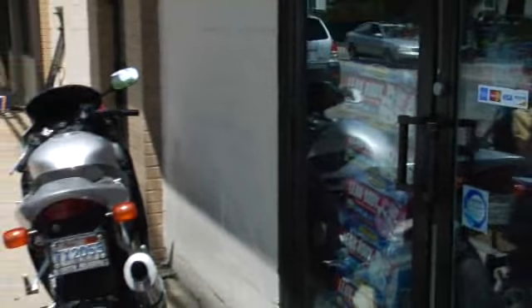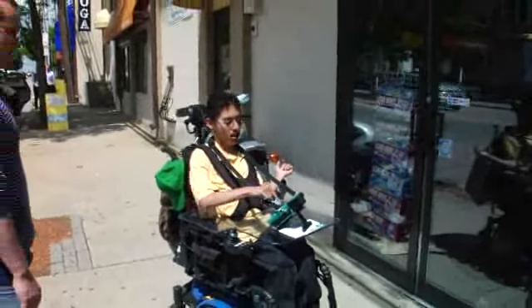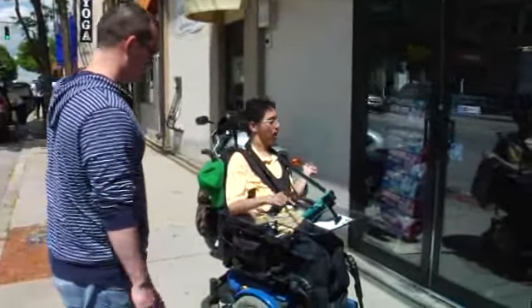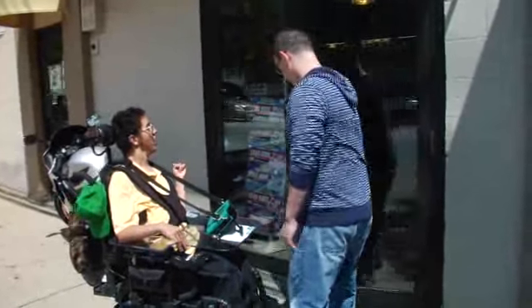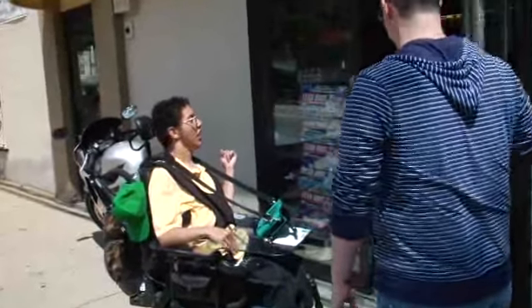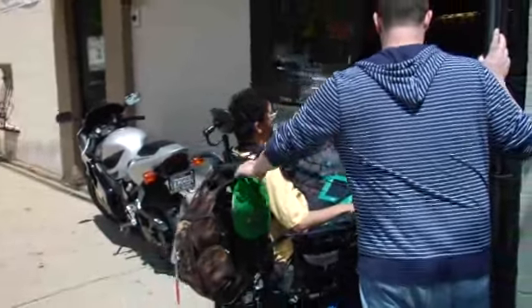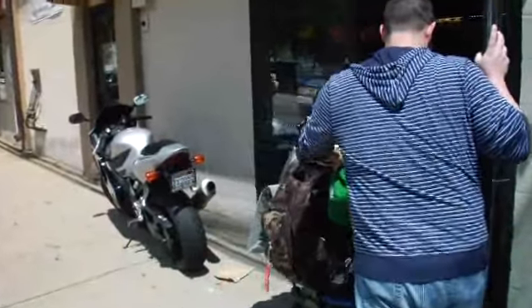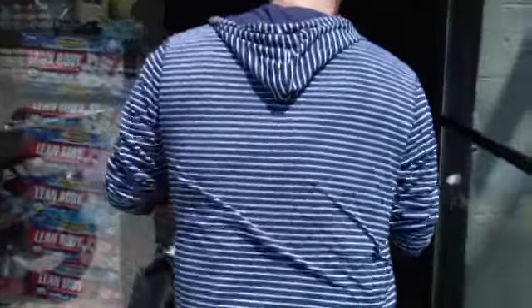In a video clip, a young man operating a motorized chair and an instructor with short dark hair make their way down a sidewalk and approach a storefront door. The young man stops his wheelchair parallel to and slightly back from the door opening. When the instructor pulls the door open, the young man moves the chair forward and turns it 90 degrees to the left to enter the doorway. The instructor assists him in moving over a raised threshold.